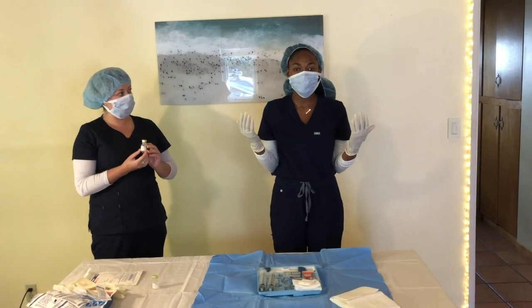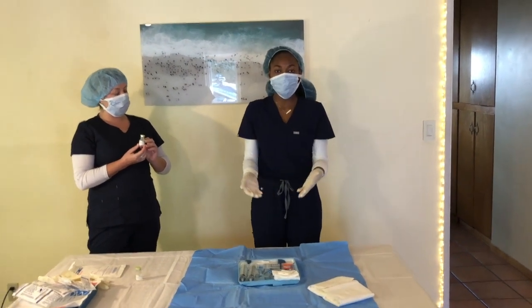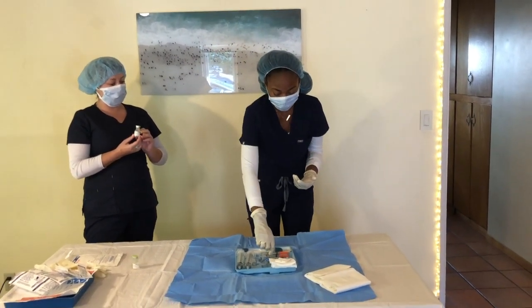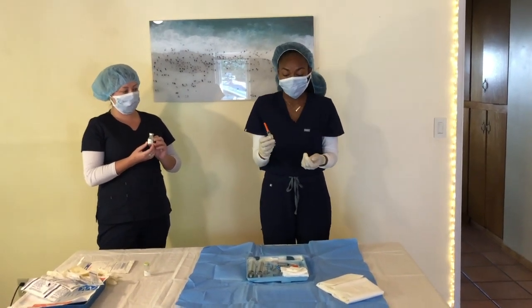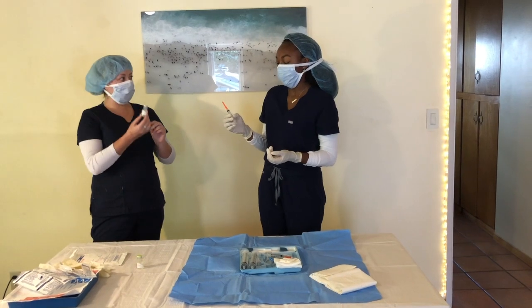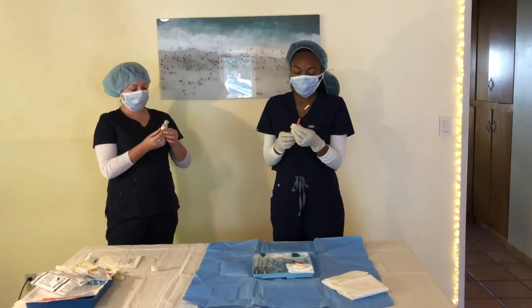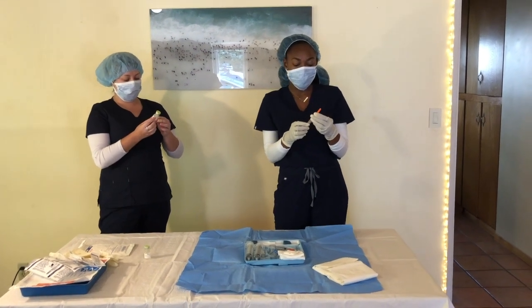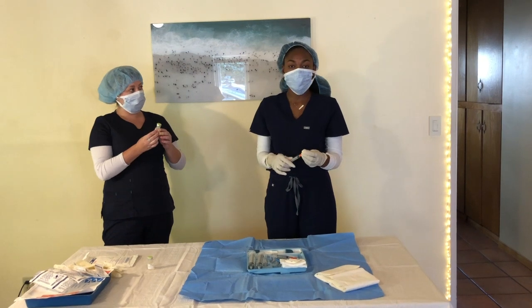Hello, so I am the sterile tech, and the other sterile tech, Tegan, had already organized the tray for me. I just put on our drawing syringe, so our drawing needle, so that we can draw some sodium chloride. She's gonna help with holding while I draw. First I'm gonna do 3 cc's of the first bottle. We have 2 of the same. Sometimes the doctors like both.